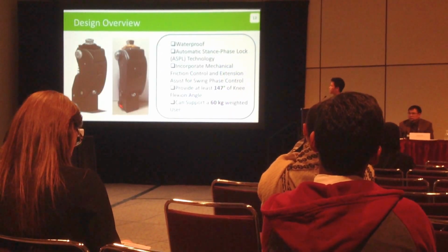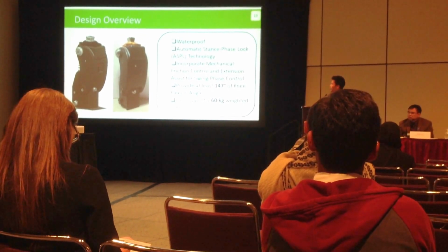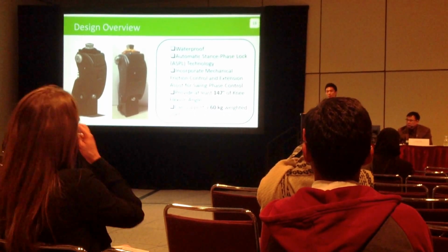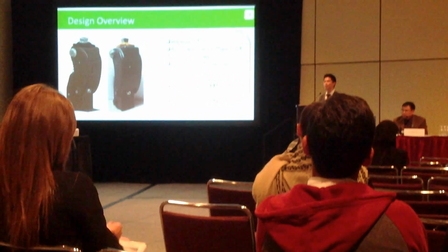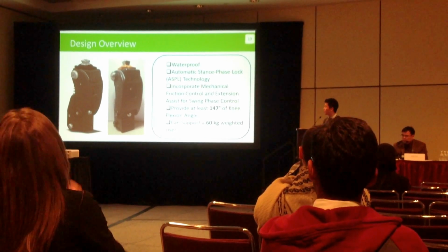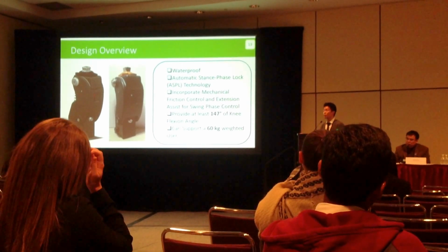So, here's the design overview. Perhaps one of the most interesting points is that our design is actually waterproof. We think that is a very important feature to have because we want the child to be able to experience different things, to be able to simply go to the beach or do water activities with their peers and family. And actually, a lot of the knees in the market right now are not waterproof.